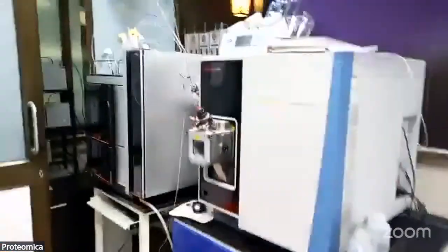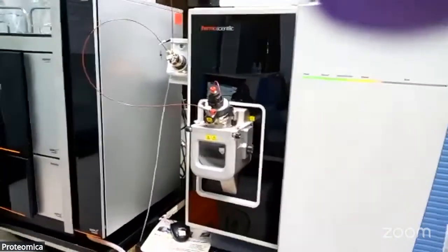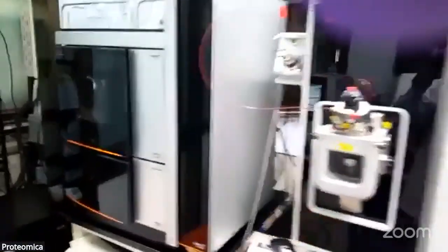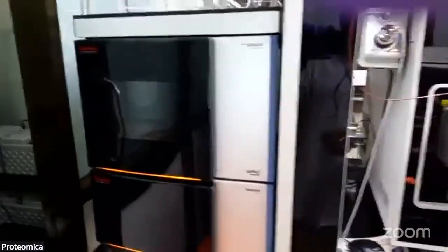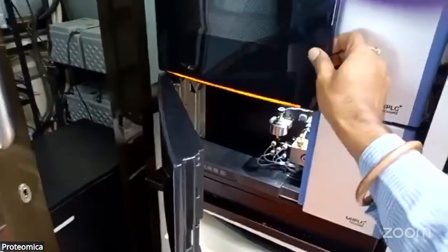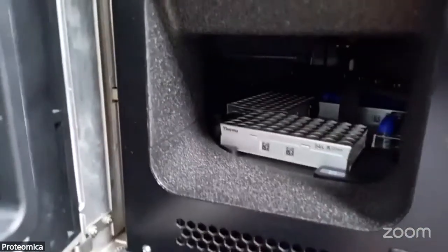This is another instrument which, to be briefed, as the professor told, we can perform SRM and PRM on. This is a triple quadrupole. We also have a higher version of the HPLC here, which is the Vanquish HPLC. Similarly, you place your samples inside the component. So this is the sample compartment. You place your samples inside.